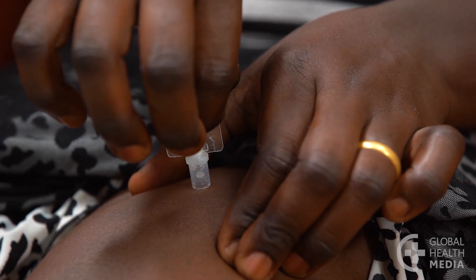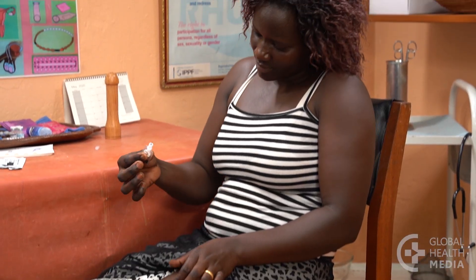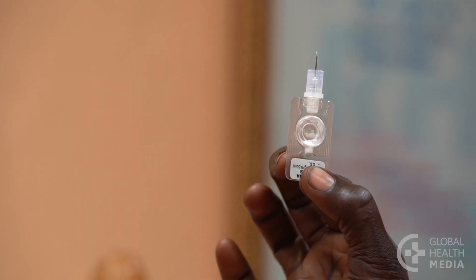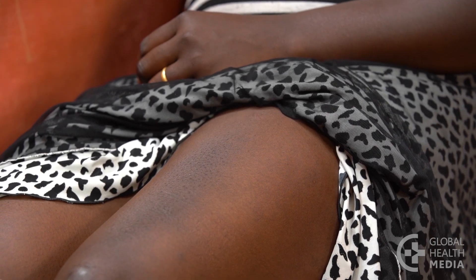She presses her fingertips directly and firmly into the bubble and counts slowly to seven. Then she relaxes her pinch and removes the needle. Tell the woman not to rub the area, to let the medicine absorb slowly.